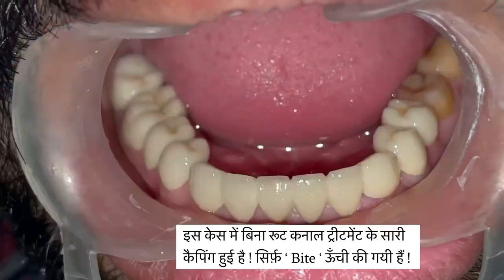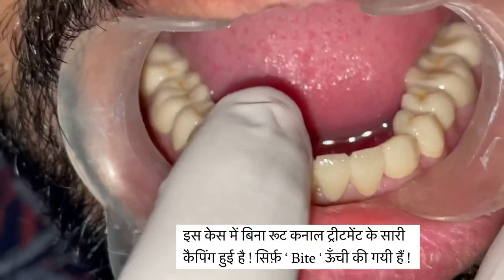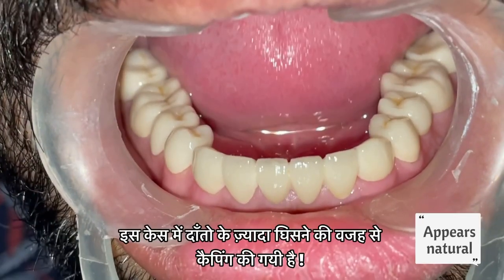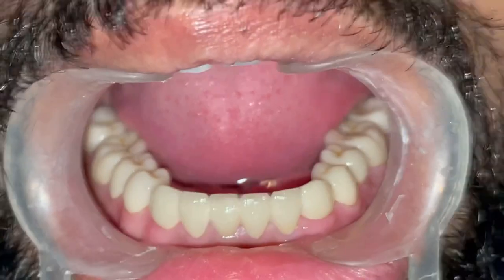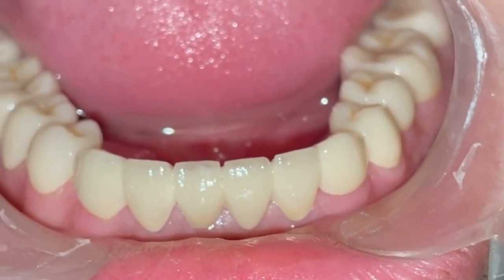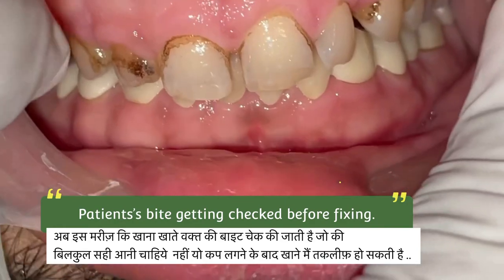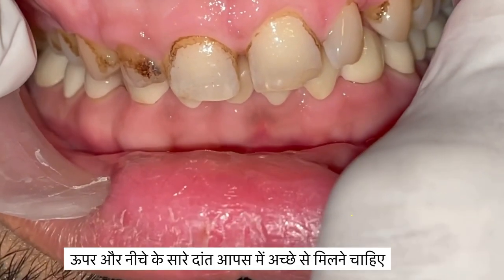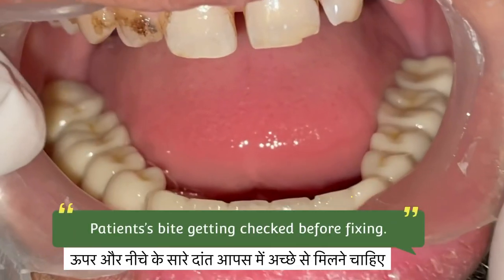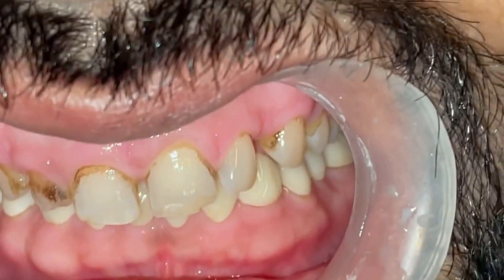Here we have raised the bite of the patient, and not even done a single root canal treatment before capping. Now we are going to check the patient's bite — it's a very important step because we have to see that all the teeth should be in direct, uniform contact with each other, so that the patient can chew food properly.